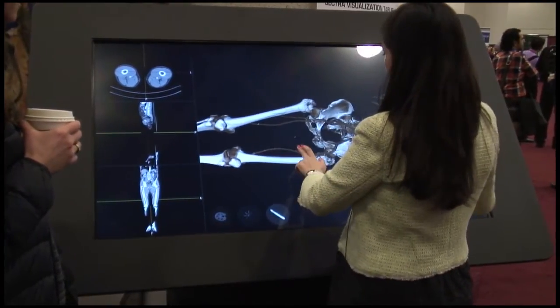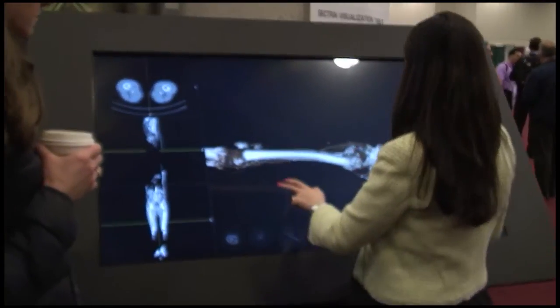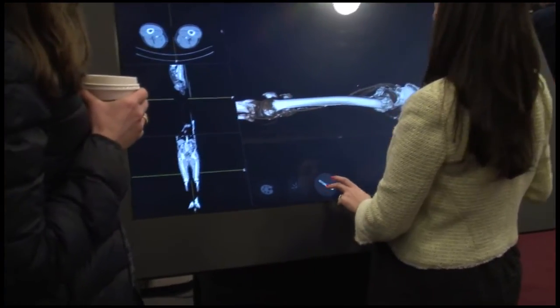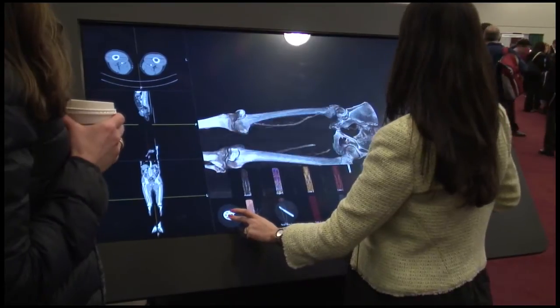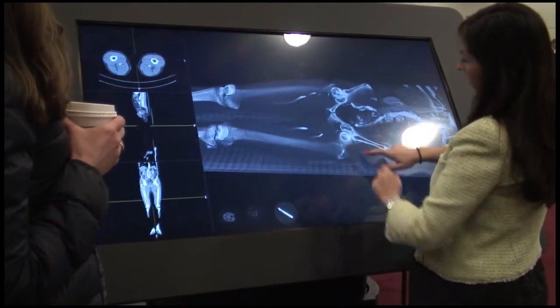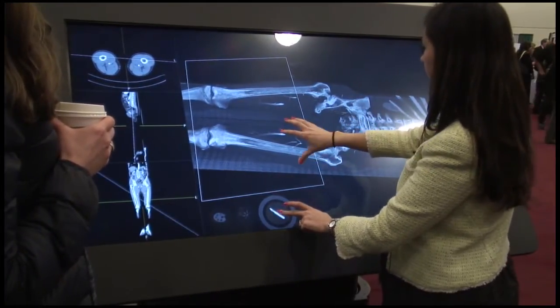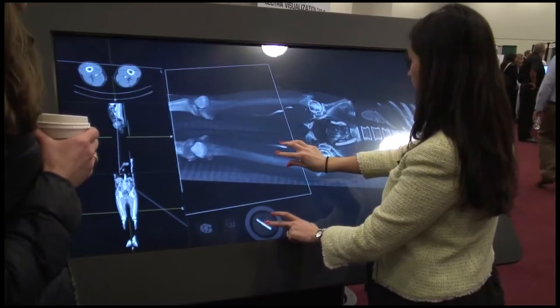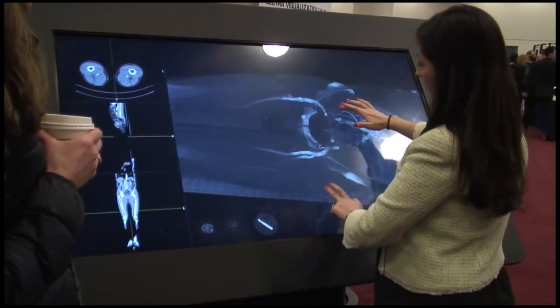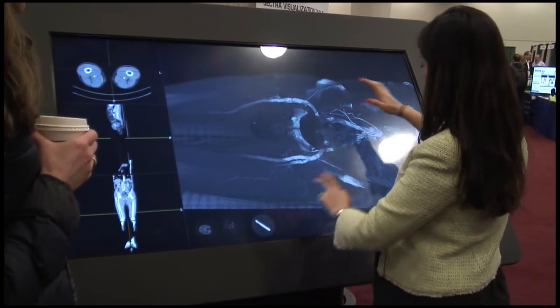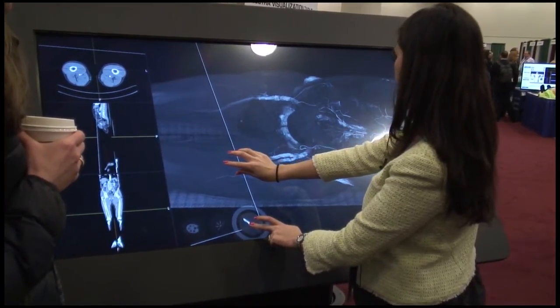Depending on what I want to see, I can change different presets. So if I do a cut like this and then I change to the organs, I can see a little bit better here depending on how deep I want to go. I can also search, for example, all the arteries.